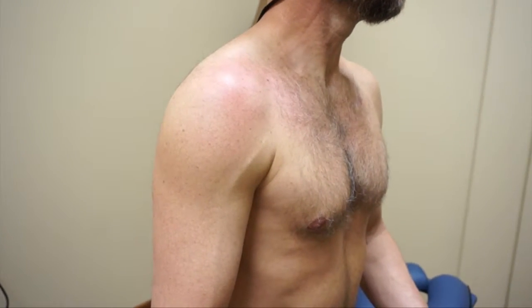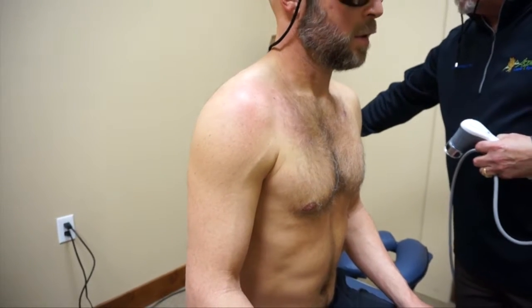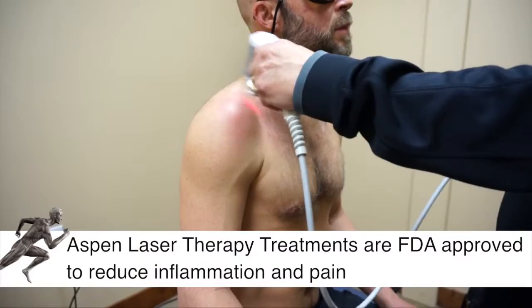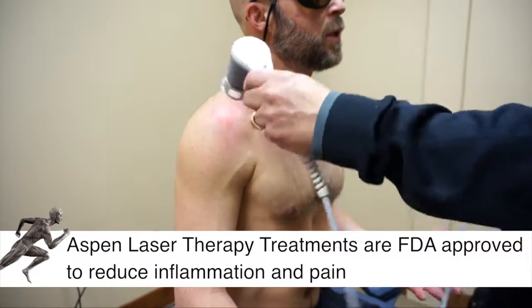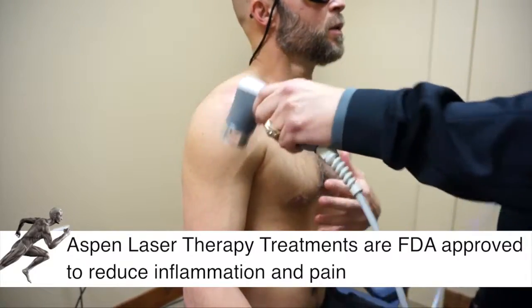At 50 watts I get much more flexibility with how much I'm going to be putting in. You work with the Tigers at the university — football or across the board athletes? Mainly football. I don't have time to do 15 sports.